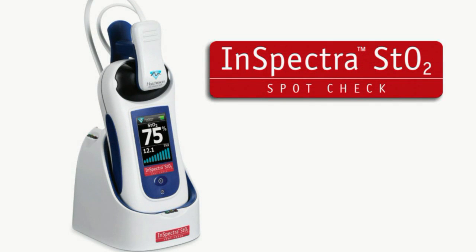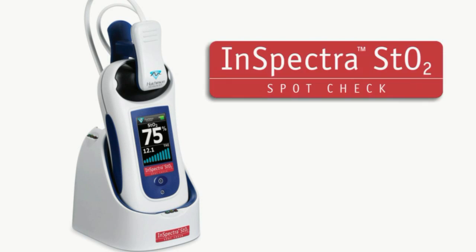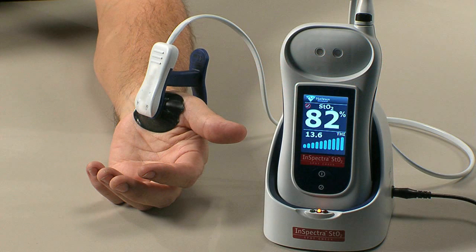This module introduces you to the InSpectra STO2 SpotCheck system, its basic operation and unique system features that support effective use. Carefully review the user manual to fully understand the device, its operation, and the potential risks to user and patient before using InSpectra STO2 SpotCheck.